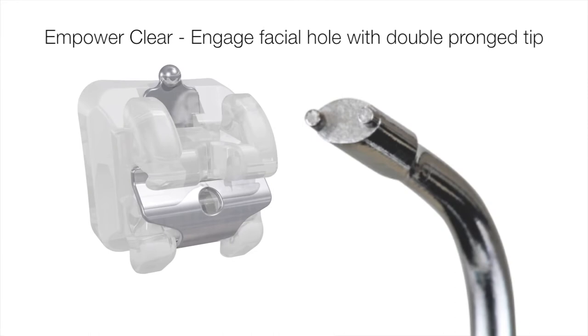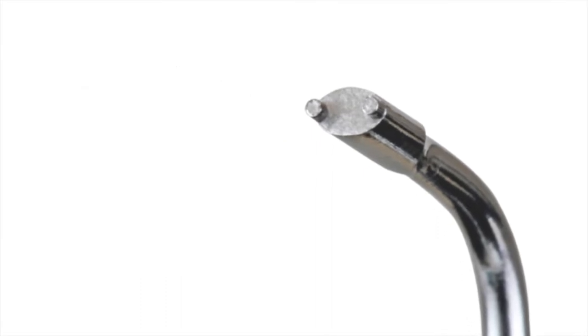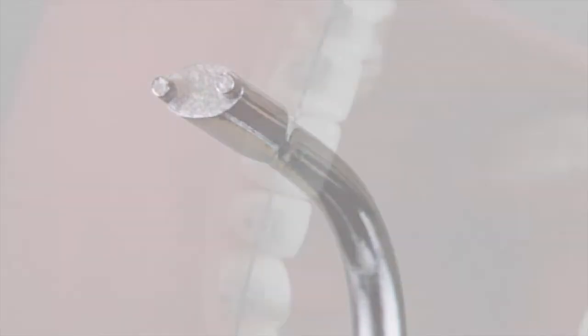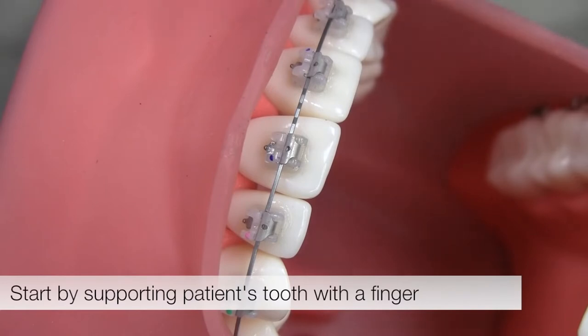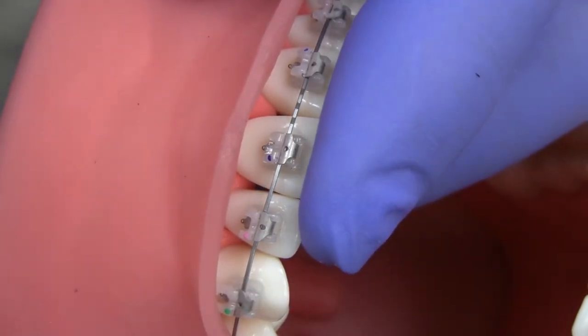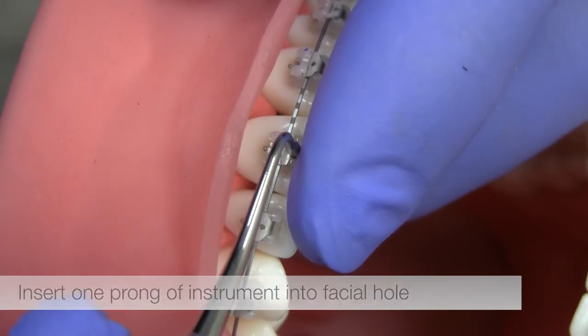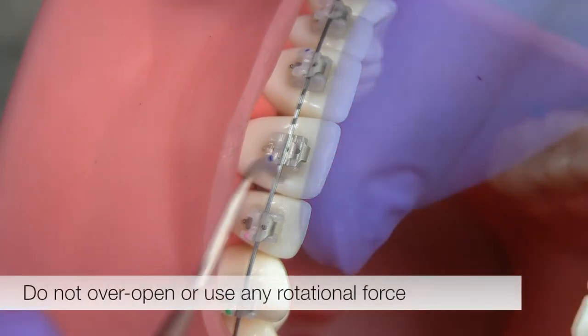The easiest method for opening Empower clear is to engage the facial hole using the double prong tip of the opening instrument. The double prong allows the instrument to be used by both right-handed and left-handed people on both the right and left hand sides of the mouth. Begin by supporting the patient's tooth with a finger, and place the finger to also act as a stop limiting the clip's opening. Insert one prong of the instrument into the facial hole and slide the clip occlusally to open.